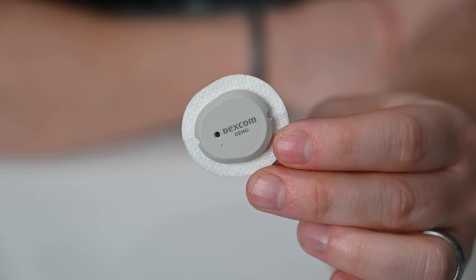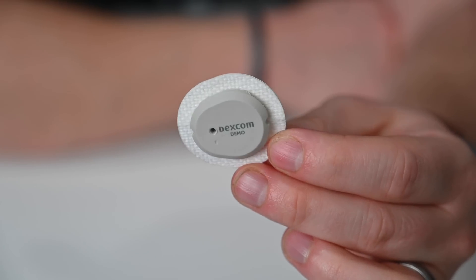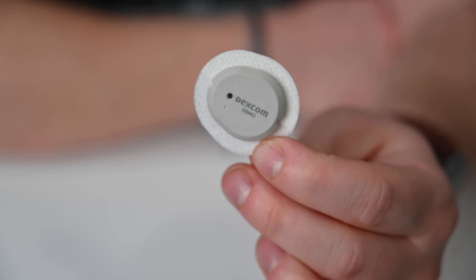Each insertion tool will be single-use — it comes all ready to go. Open it, insert, toss the tool, and you're ready to go. This is only a demo unit, so I don't have full access to data yet and can't test it on myself. Dexcom says it is more accurate, and I'm excited to test this out when it fully launches.